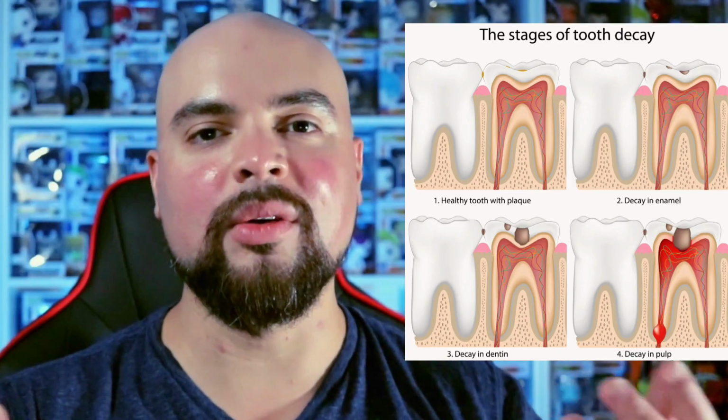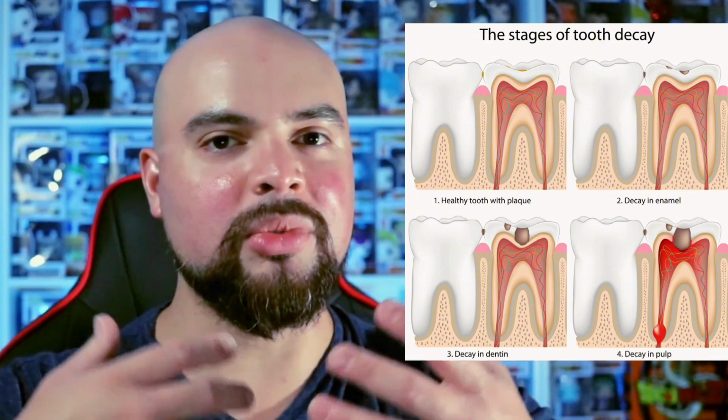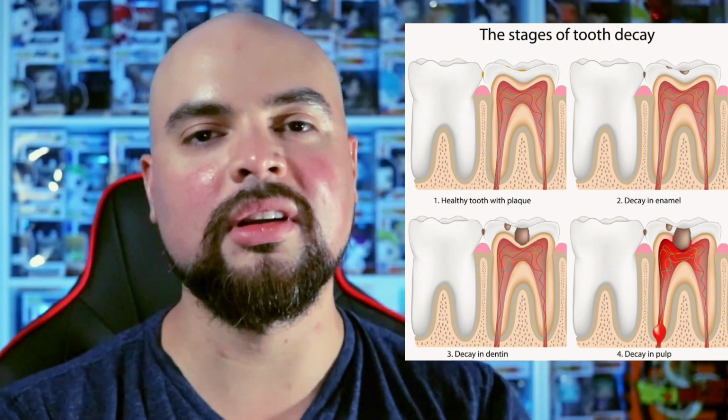Think of it as how a cavity can happen. Over time, it breaks down the enamel and so forth. If you have a tray that has soda or food particles stuck right up against your teeth and you don't take it out or clean them until the end of the night, you're doing damage to your teeth. It takes a strict discipline to make sure that you're doing your Invisalign justice. You're spending all this money and all this time. Make sure you do it right.